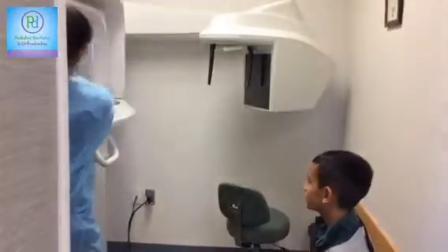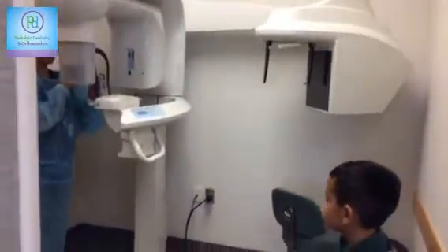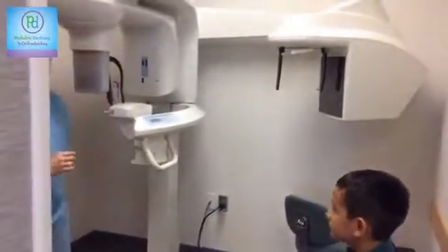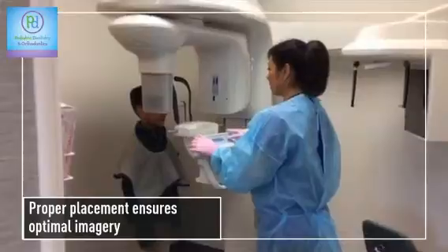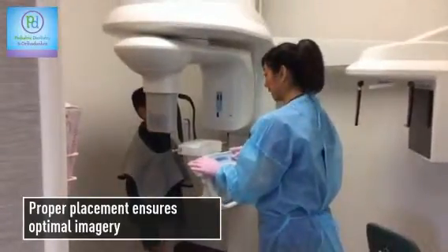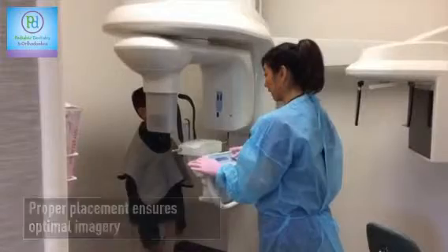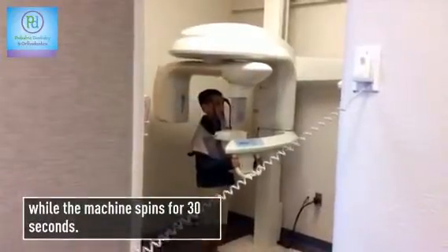When you stand over here, you're going to stand right here, you're going to rest your chin right there. Let me get the machine set up and I'll be right back.